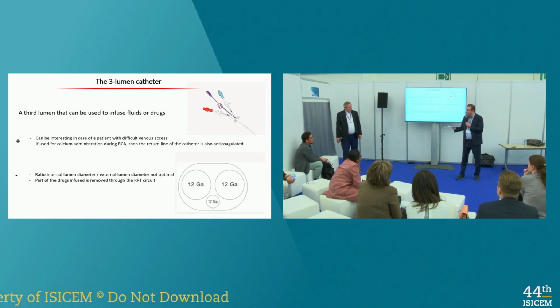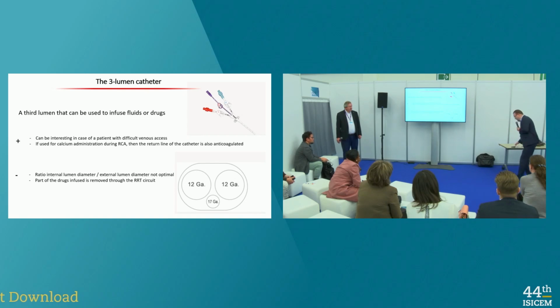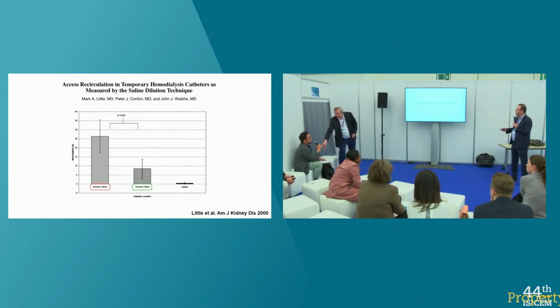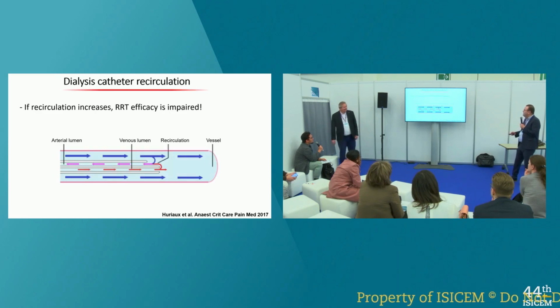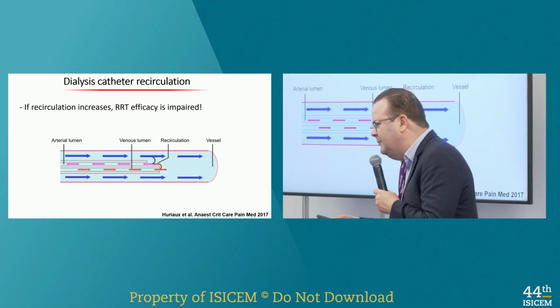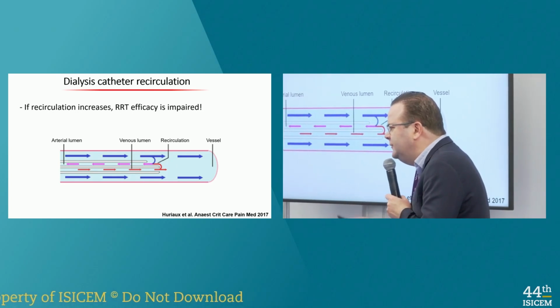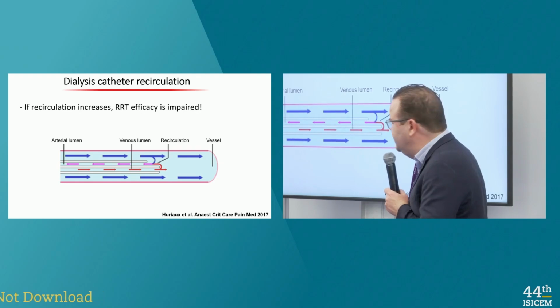The other problem is, why do you want to switch your line? Sometimes it's because you have a pressure problem, right? Like an entrance pressure, very negative. Yes, it's always very negative. So you switch lines and then it can fix your problem. Usually it doesn't fix it for a long time. You just gain a few hours. Okay.